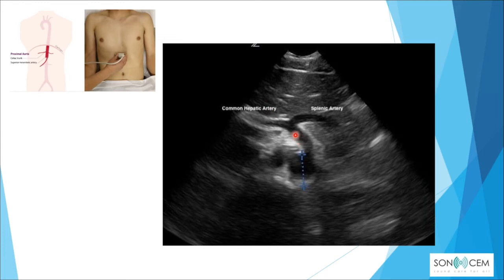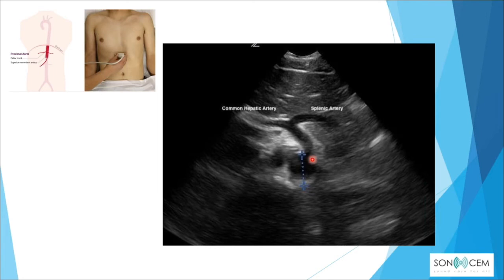The celiac trunk branches into the common hepatic artery and the splenic artery. For the abdominal aorta, the measurement method is outer wall to outer wall. To measure the diameter, scan through the whole abdominal aorta, find the widest diameter available, and measure from there.